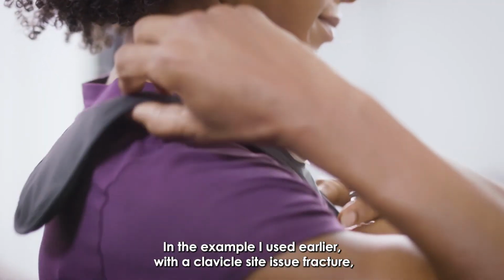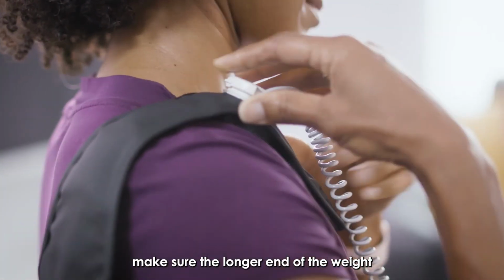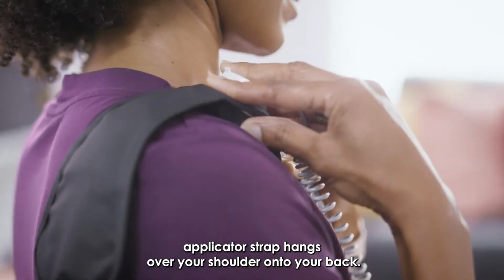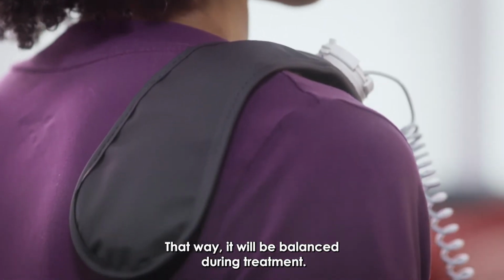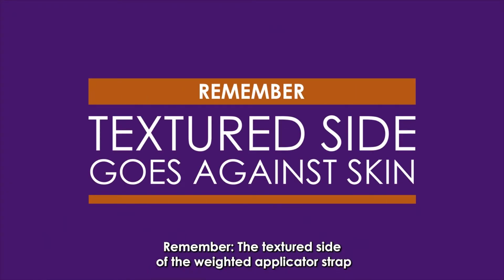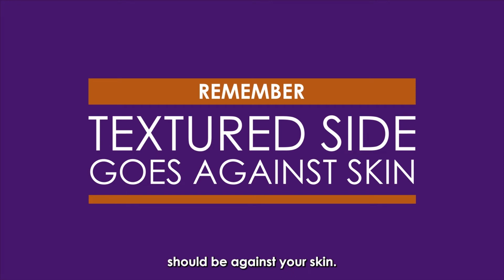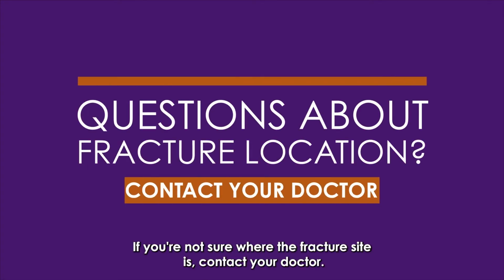In the example I used earlier, with a clavicle fracture, make sure the longer end of the weighted applicator strap hangs over your shoulder onto your back. That way, it will be balanced during treatment. Remember, the textured side of the weighted applicator strap should be against your skin. Also, make sure your port is placed directly over your fracture site. If you're not sure where the fracture site is, contact your doctor.